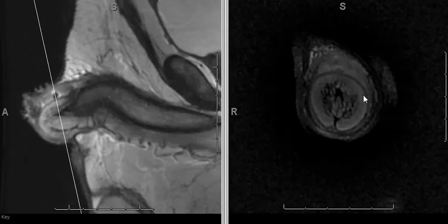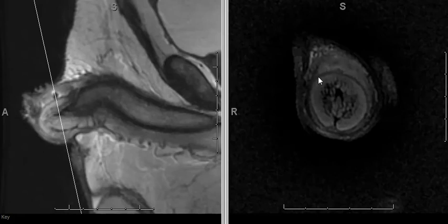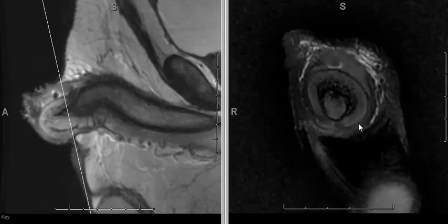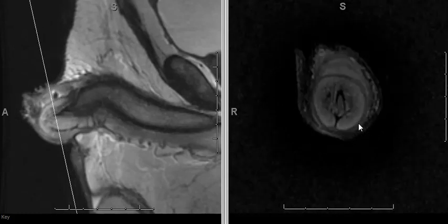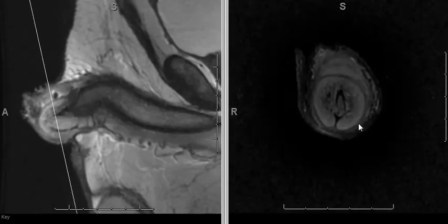What is key here is to observe that there is no tumor invasion into the glans. You can see the dark line of the fibrotic band surrounding the glans, which is intact. So this is a tumor of the skin alone without invasion of the glans.